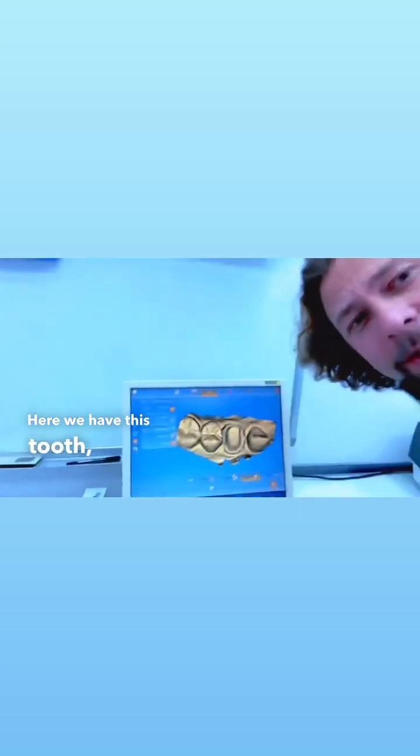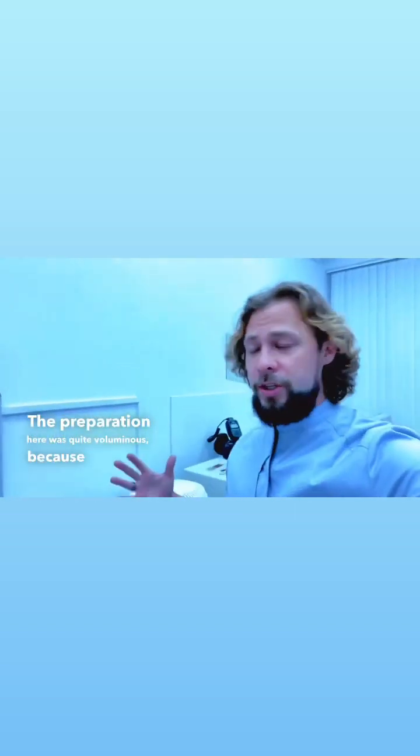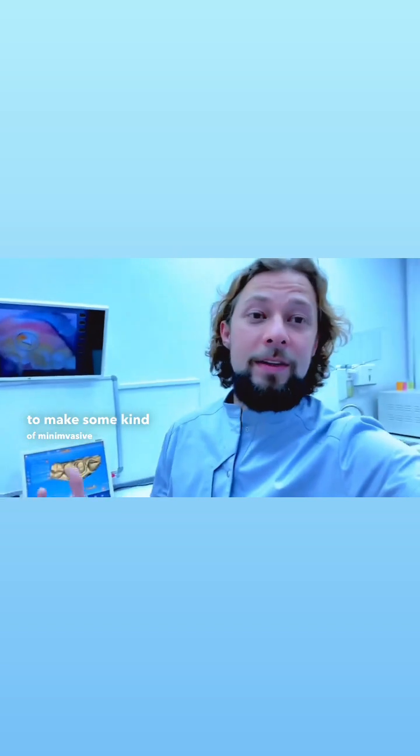Here we have this tooth, which we have prepared for a ceramic crown. The preparation here was quite voluminous because, since the teeth are depulpated, I no longer see the point of preserving the hard tissue of the tooth in that volume to make some kind of minimally invasive preparation.